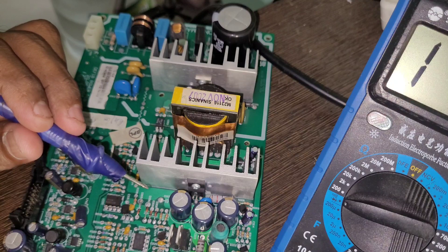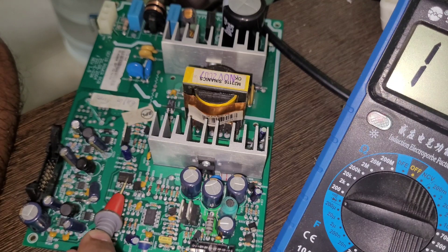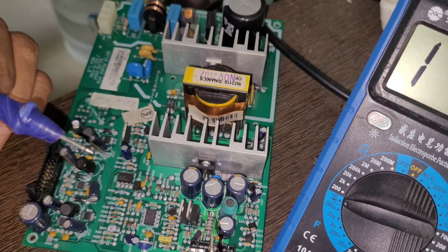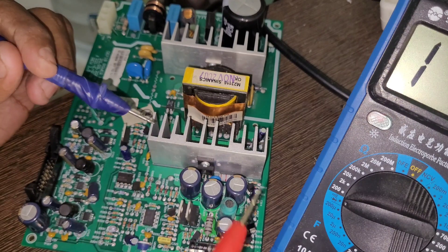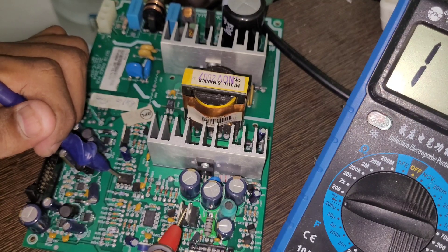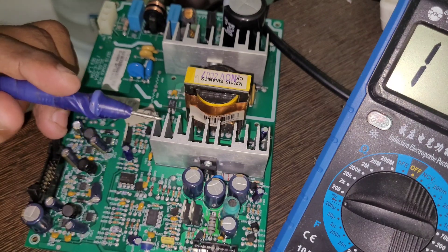I don't think there's a problem with these components. I am assuming the problem is with this IC or this IC — this is a comparator: LM358 and LM393. Why? Because I have seen a lot of this type of board and the problem is usually with these ICs. There is no blown or broken component visible, so we can assume it's one of these ICs.